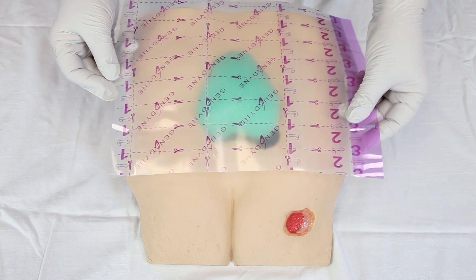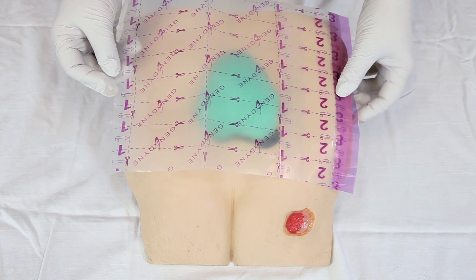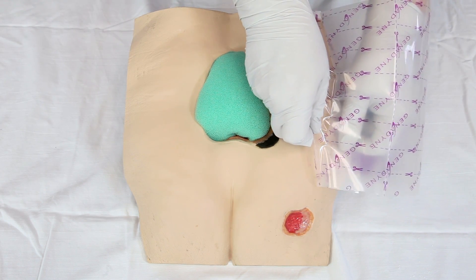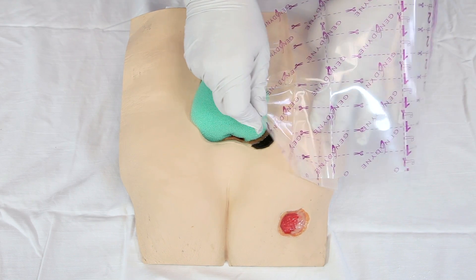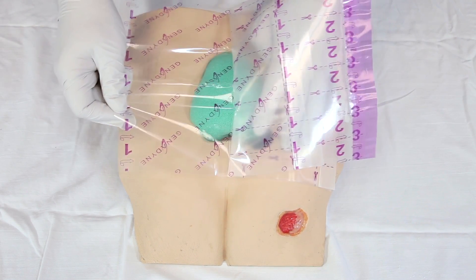Center the film over the wound site, allowing at least a two-inch margin around the wound to ensure a proper seal. Remove the transparent film backing using a rolling technique, and apply conforming to the skin as you go.